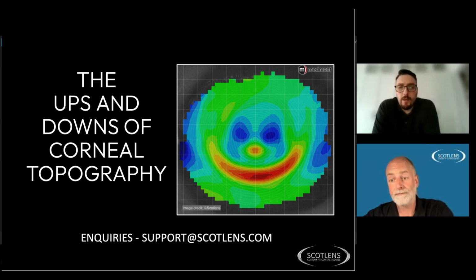Perfect. How does corneal scarring impact it? If you've got a patient who's maybe had an issue with soft lenses, maybe a bit of MK, and wants to switch to a night lens, how would that corneal scarring impact the measurements? Topographers tend to build their image from the middle out, so most of them aren't even going to pick up peripheral ulcers. The Medmont will probably pick up on them right at the very edge. But if they've got central scarring, it tends to throw off the reading.